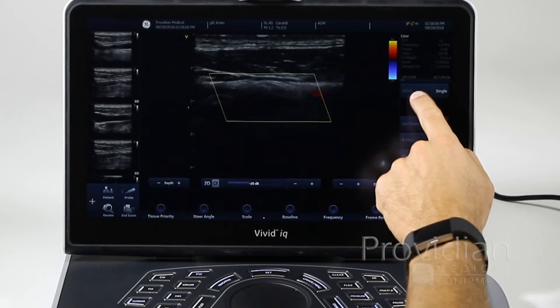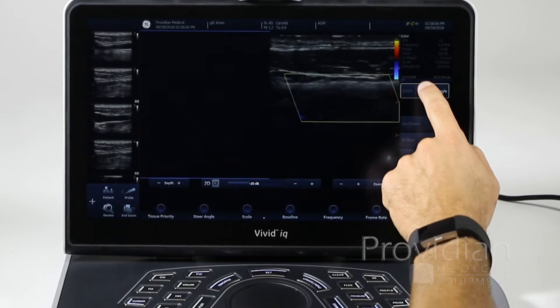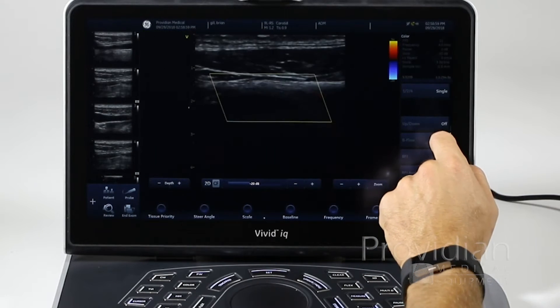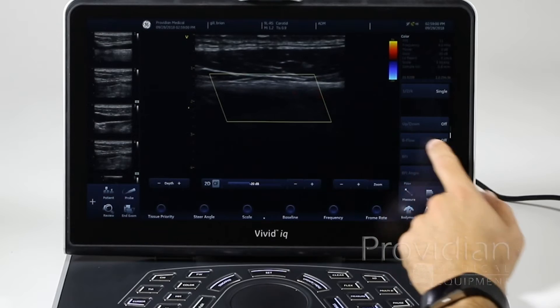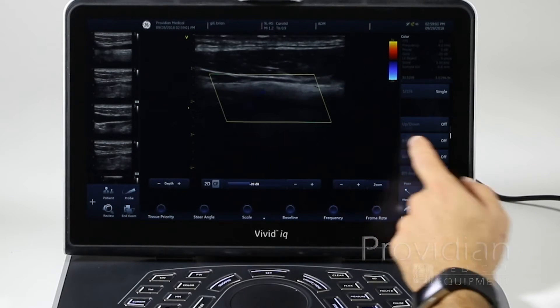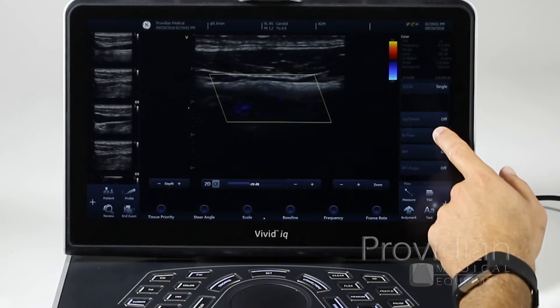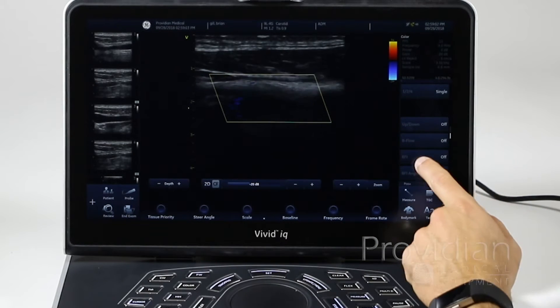And single, dual, or quad screen. Up, down, B-flow — we saw that.